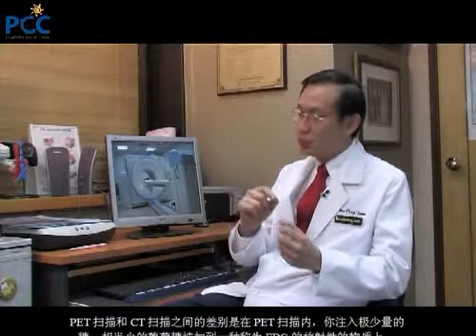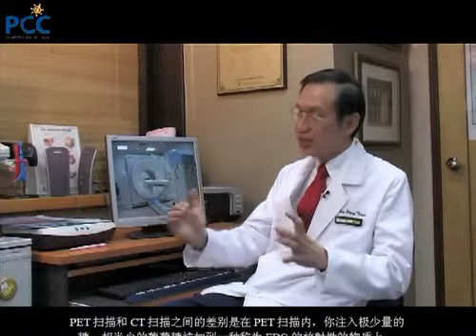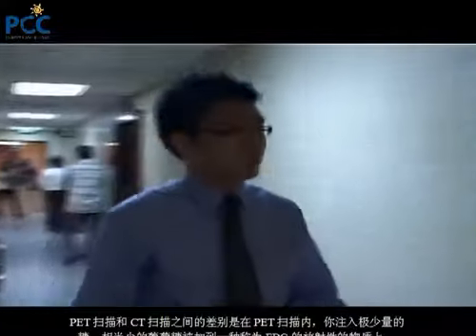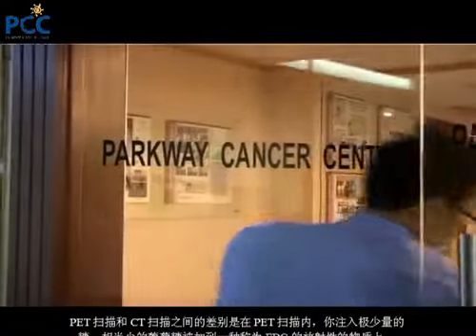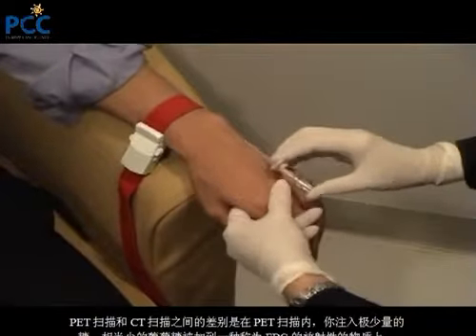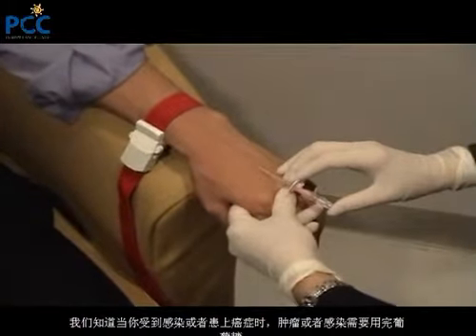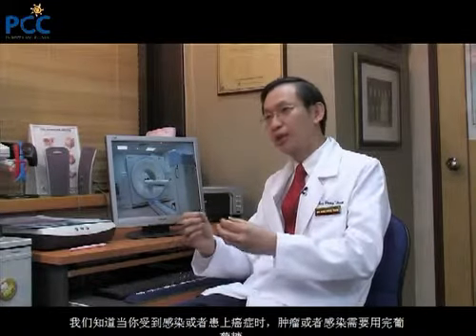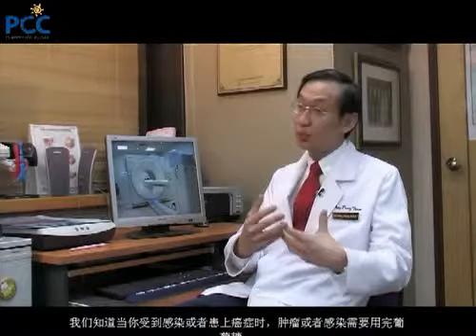The difference between a PET scan and a CT scan is that in a PET scan, you inject a tiny amount of sugar, a little bit of glucose, that is tagged on to a radioactive substance called FDG. And we know that when you have an infection or you have cancer, the tumor or the infection needs to use up glucose.